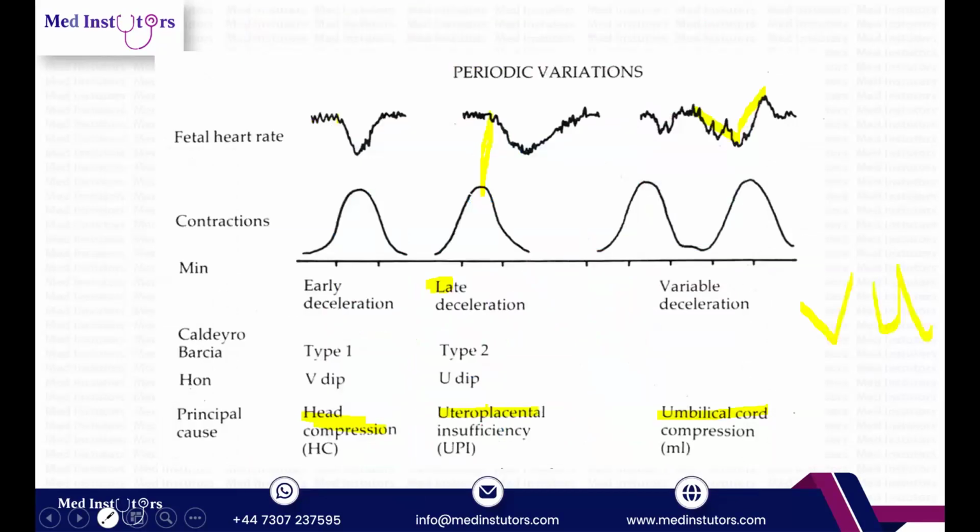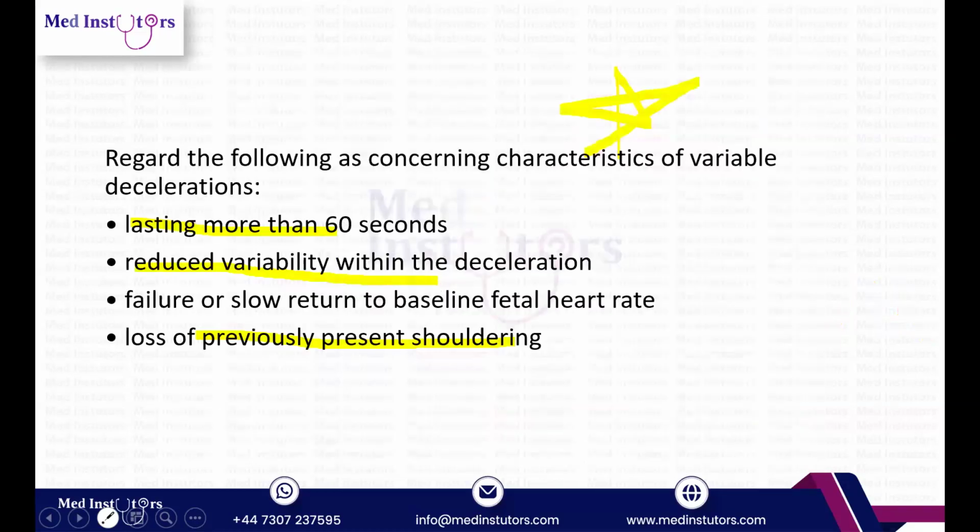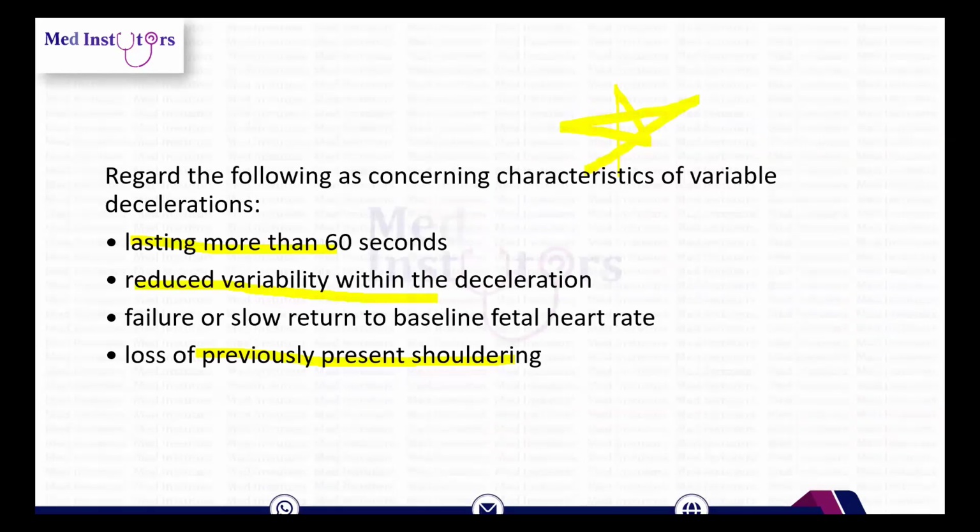This picture is important. I want to make a note. I want you all to remember this. This is how you all will be able to understand early, late, and variable. Okay. So, I'm at the end of my session today, guys. I hope you all understood this. Fetal scalp stimulation is by just doing a per vaginal examination and trying to stimulate the fetal scalp with your finger. Okay.